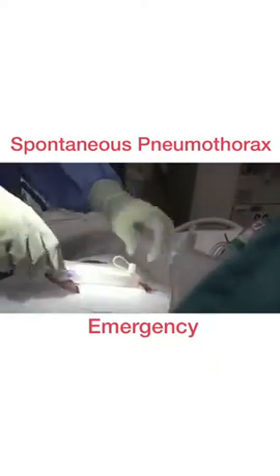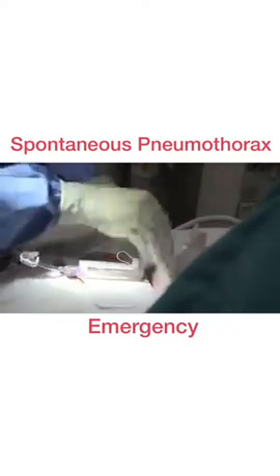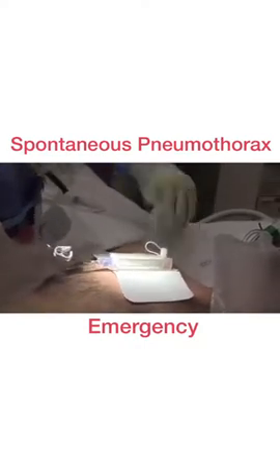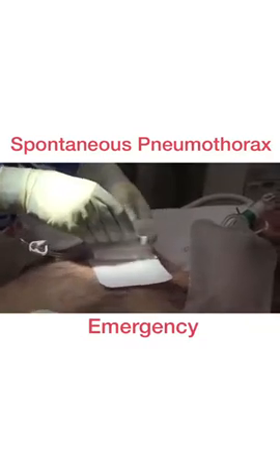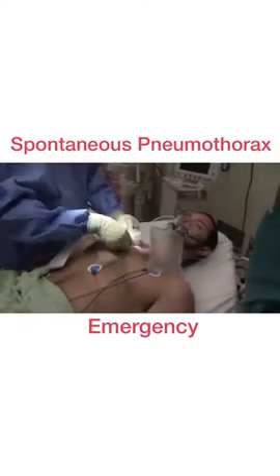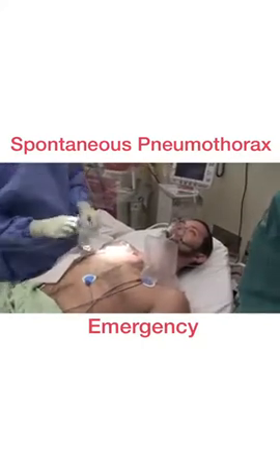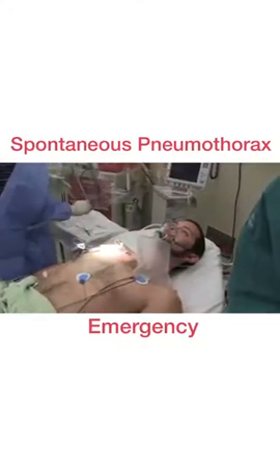Doing all right, Patrick? Yes, sir. Okay. Tell us if you're feeling bad. And that is essentially it. We got low intermittent suction on, Renee? That's fine. Are you nauseated or anything like that? Sometimes there's a vagal type response that you get after a needle is put in your chest. All right, but you're done.